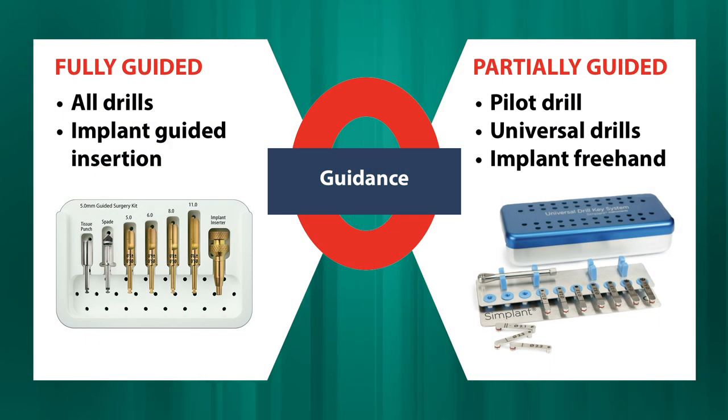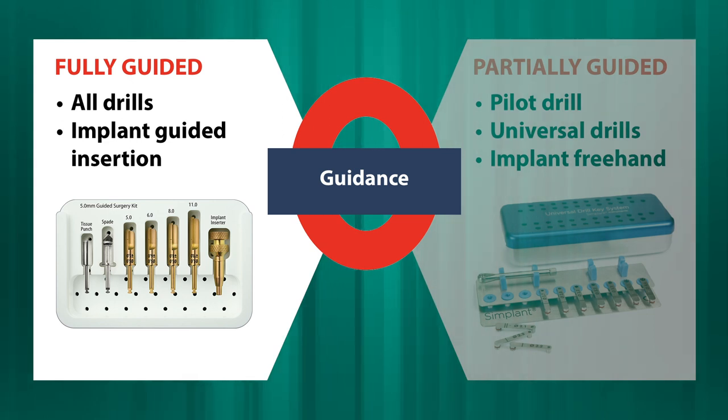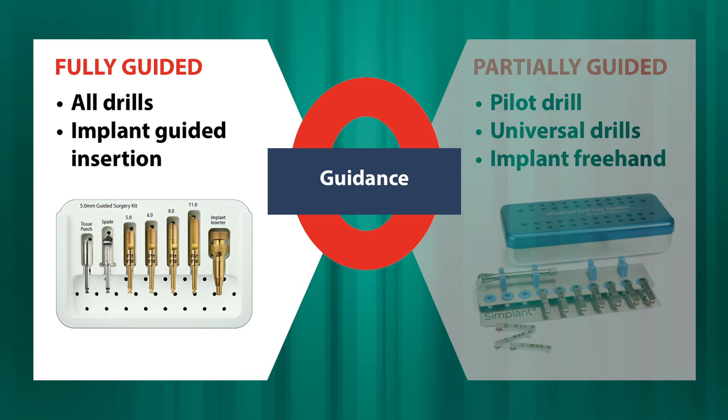These surgical guides can facilitate either a fully guided or partially guided surgical approach. In a fully guided approach, you need to use a fully guided implant kit. Implant drilling or osteotomy preparation is performed through the surgical guide. Implant placement is also performed while the guide is still in place.